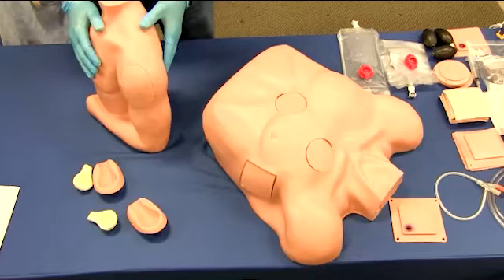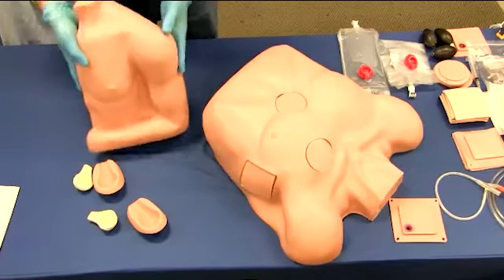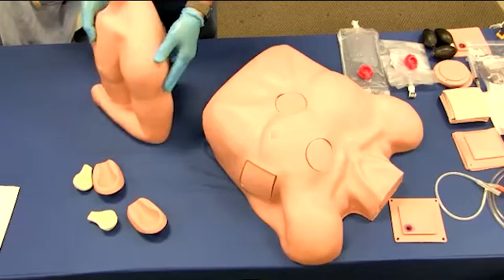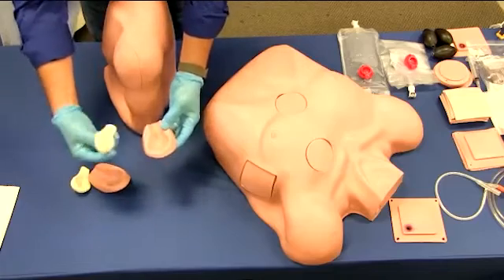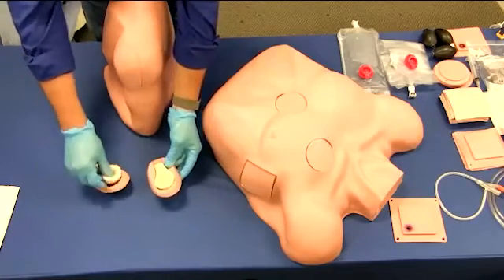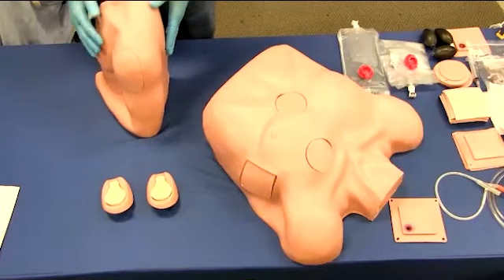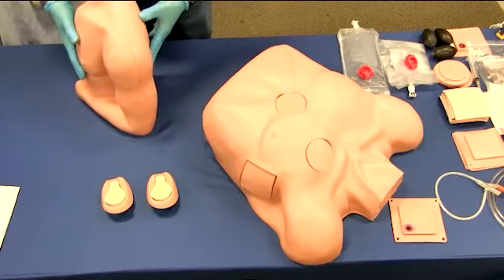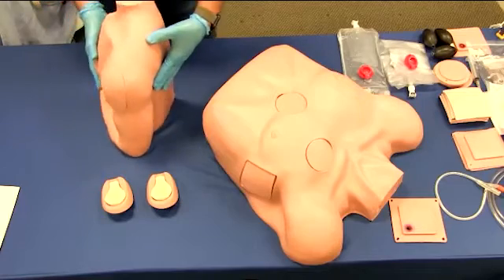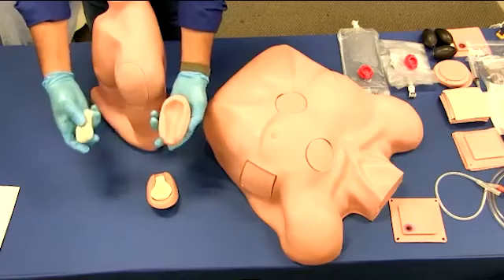The humerus IO trainer includes the half torso you see here, along with a package of three replacement injection pads and three replacement bones. This trainer includes a three-year manufacturer's warranty. Replacement bones and injection pads are available. For your reference, the part number for a package of replacement pads and bones is 101-206.